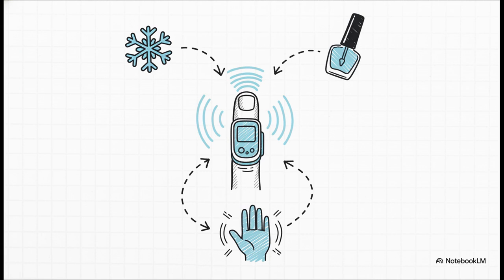But as a sharp medical student, you've got to be aware of surprisingly common factors that can totally skew these readings. Cold extremities, motion artifacts, the literal absence of a physical pulse, physiologic states like methemoglobinemia, certain medications like methylene blue, and even something as simple as the patient's nail polish can dramatically alter that light absorption, meaning a trendy manicure might just give you a completely false reading.